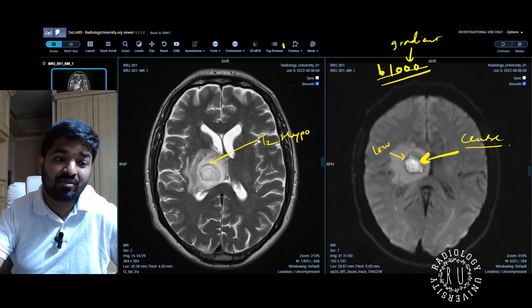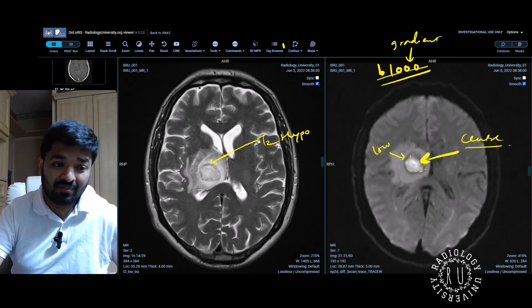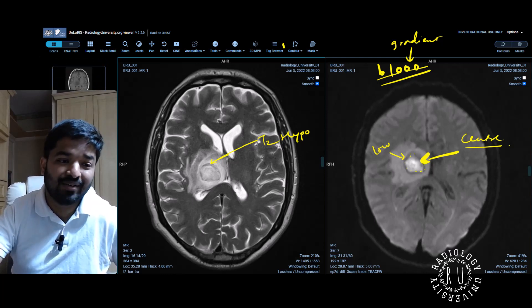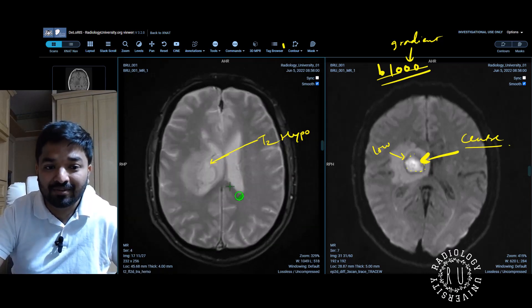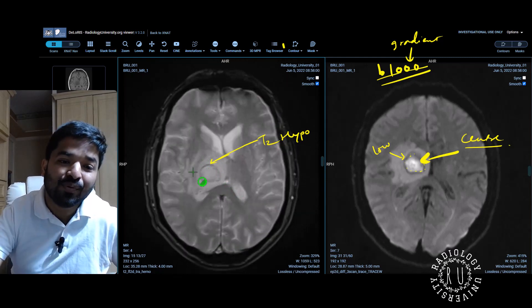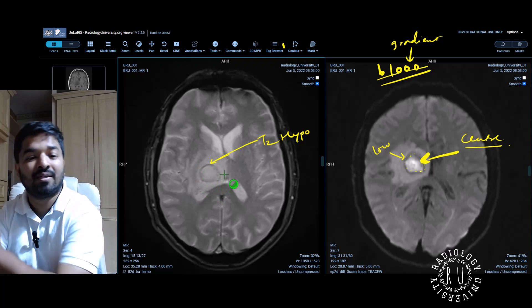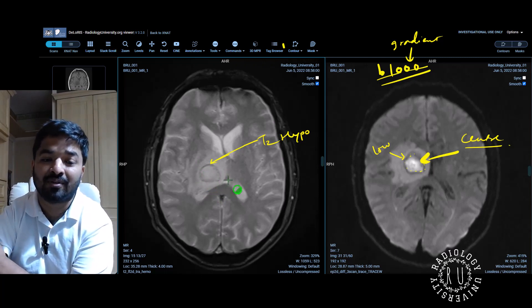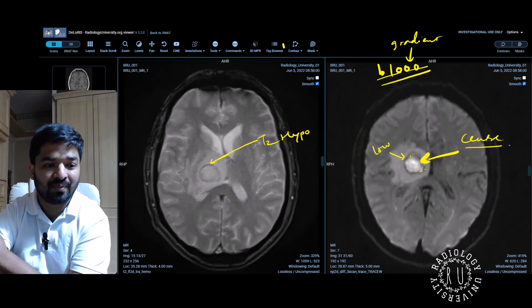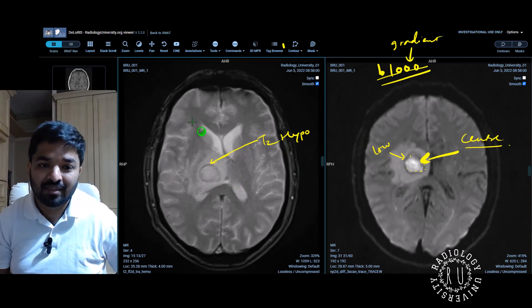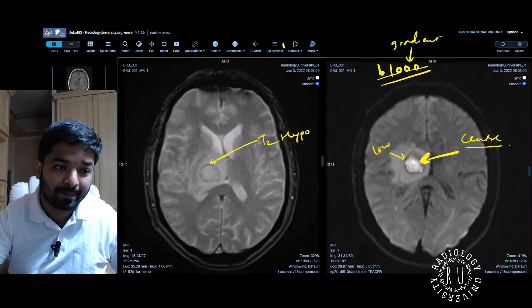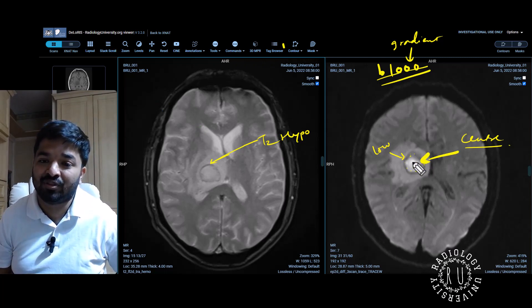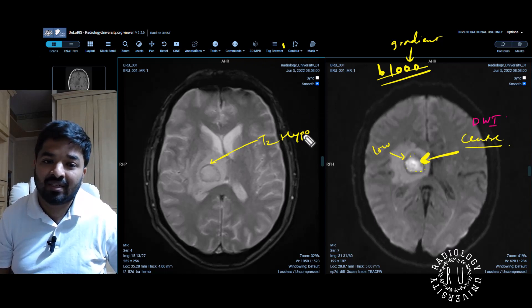Is there any way you can confirm the susceptibility artifact? Of course, you can do SWI. If you haven't done SWI, you can do a gradient echo sequence, which is like a poor man's SWI. And there you go — that's a gradient echo. You can see there is blooming around that area. If you had done SWI, you would have seen quite a bit of blooming.